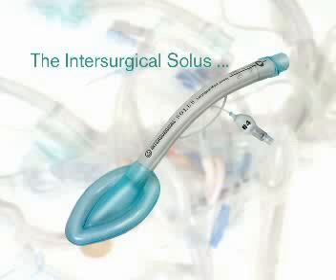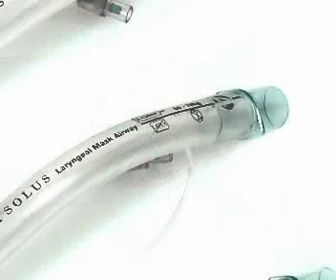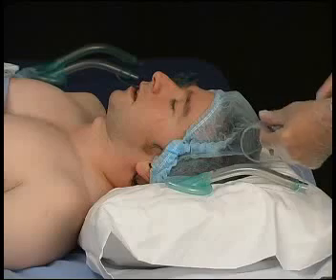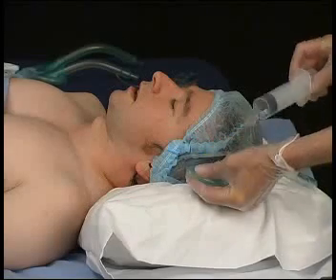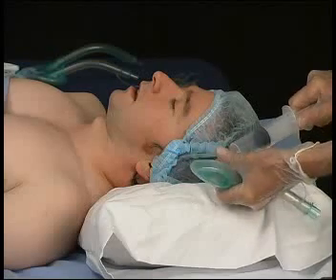What we're about to demonstrate is the correct insertion technique for the Intersurgical Solus laryngeal mask airway. Firstly, it is important that you select the correct size for each patient, and the patient weight does appear on the airway tube. Next, prepare the laryngeal mask airway by fully deflating it to a very tight vacuum, contrary to some popular belief that there should be some air in the cuff.